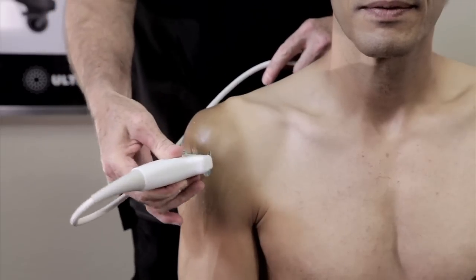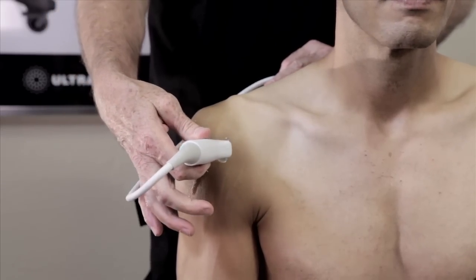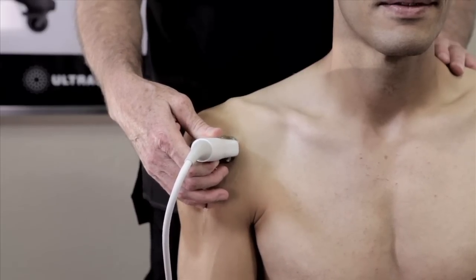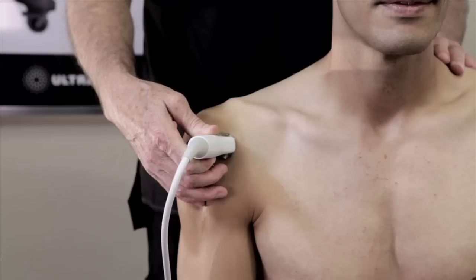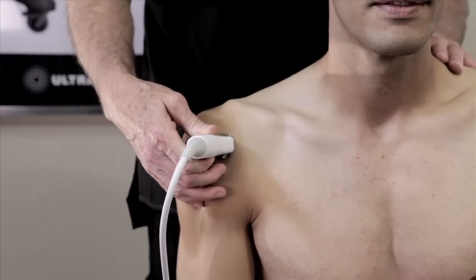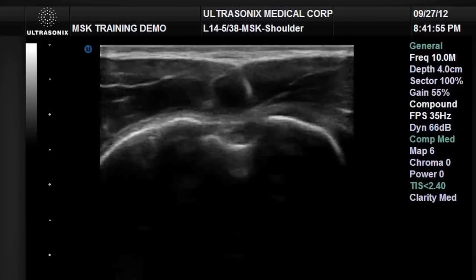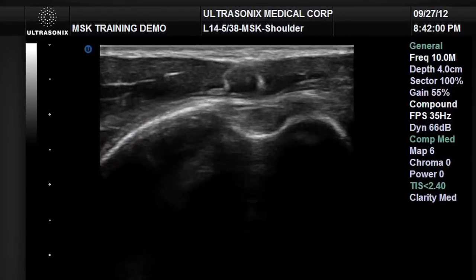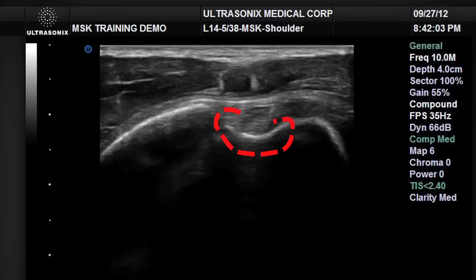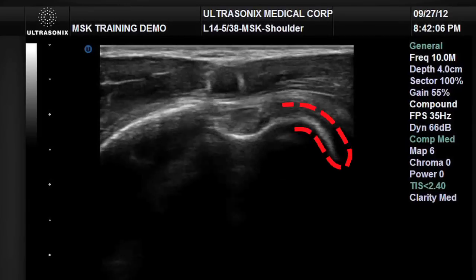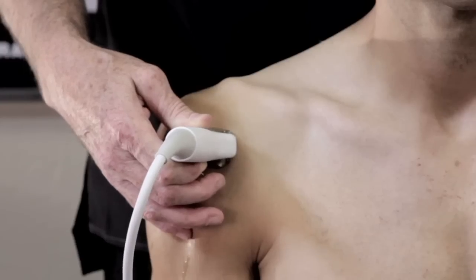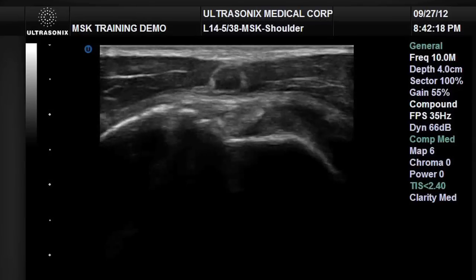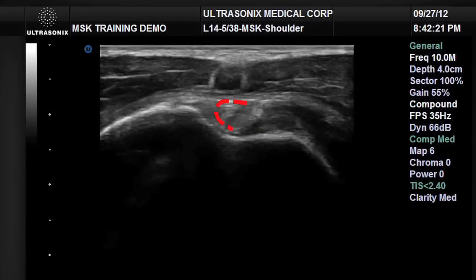We're going to hold the probe between the thumb and index finger, using the other fingers to stabilize, and place the probe in a short axis orientation in an anterior to posterior plane at the proximal portion of the shoulder. Reading the image from left to right, we visualize the long convexity of the greater tuberosity of the humerus, the dip into the bicipital groove, and on the right side the lesser tuberosity of the humerus. By toggling the probe, we visualize the bright hyperechoic biceps tendon well situated in the bicipital groove.